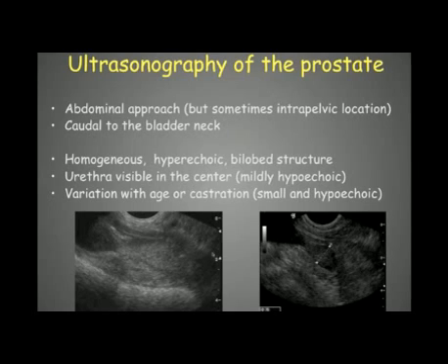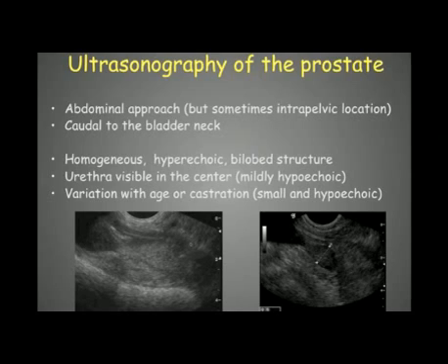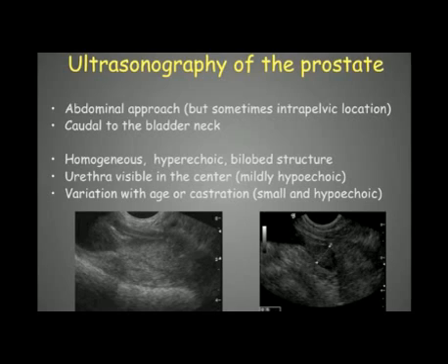Here we have the pelvic edge — the pubic bone — which can sometimes obscure the caudal aspect of the prostate. The prostate is usually homogeneous with a hyperechoic bilobite structure, shown here in a longitudinal image. The urethra can be visible in the middle as a thin hypoechoic line.